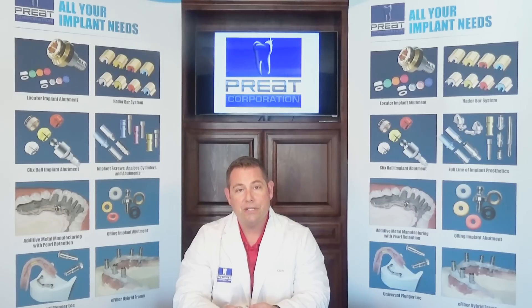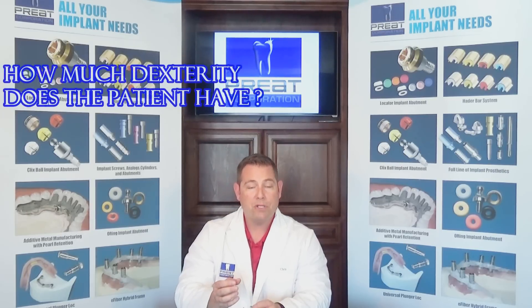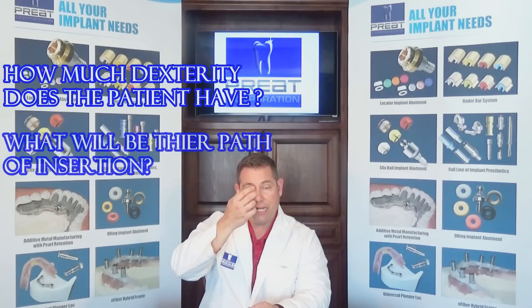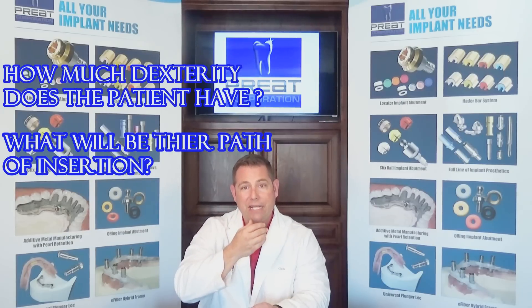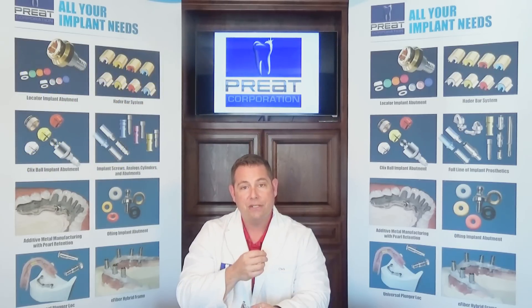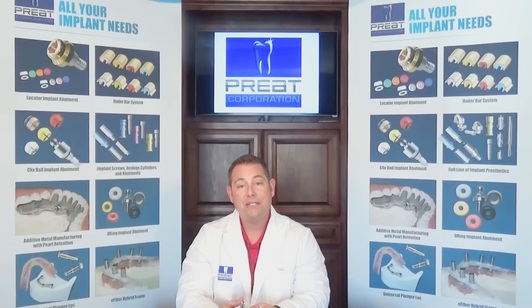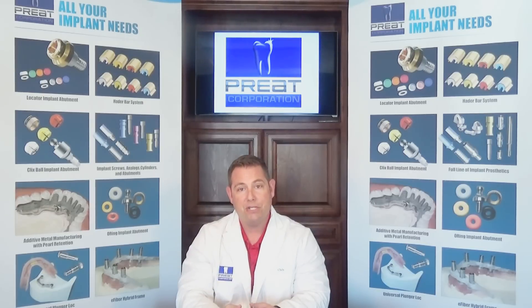The third reason that the clips could be bending or rolling in goes back to patient dexterity. If we have multiple clips, or we're using the clips with a distal extension attachment, how is the patient inserting the prosthesis? Are they coming from the side? Are they biting it? A simple chair side procedure: instead of having an assistant or the clinician insert the prosthesis, have the patient do it. Let's see what they do, and instruct them to insert it with finger pressure with their hands and not bite the clips into place.